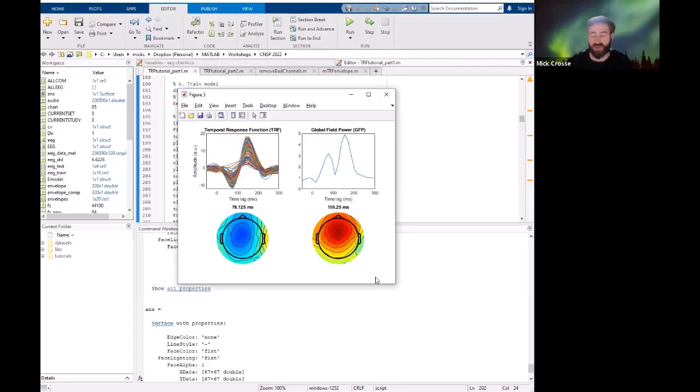So what we've done here essentially is we've created a model of how the envelope maps to the EEG data. It looks like a neural response, which is a good thing. That's check one. And the next thing we'll want to do is, it looks like a brain, but is it good at predicting brain data?